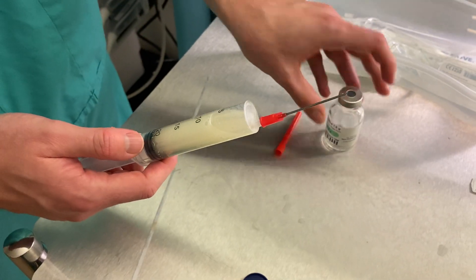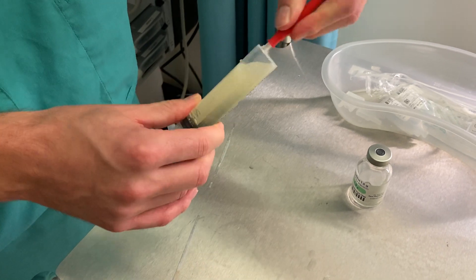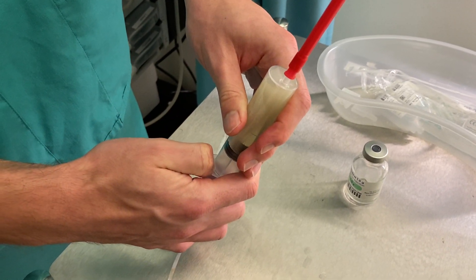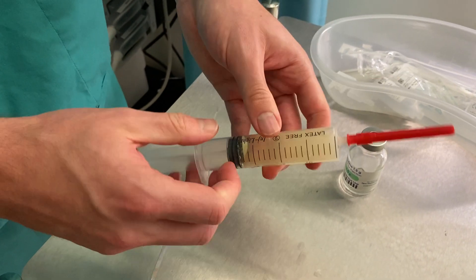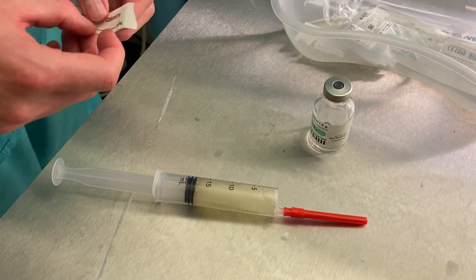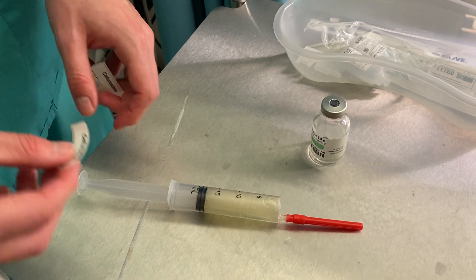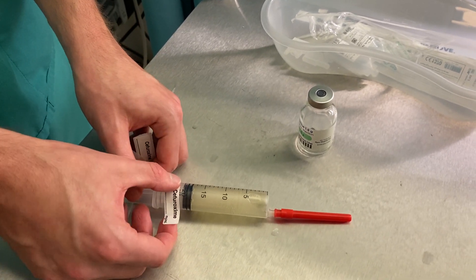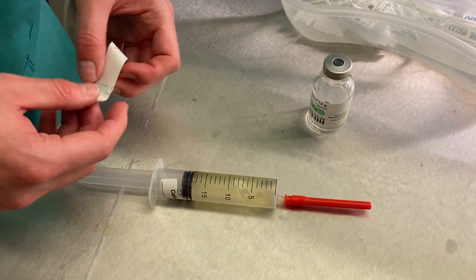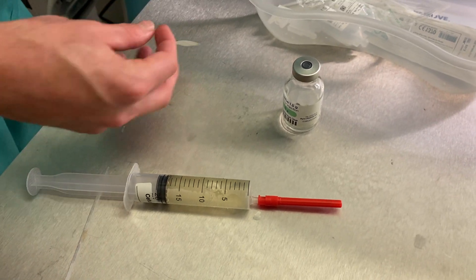If you need to make your antibiotic up to a specific volume you now can. Most of the time in theatre, once it's between 15 and 20ml or so, we're happy. It doesn't need to be a specific concentration for some antibiotics and we can give this as a slow push. Be careful of some antibiotics that need to be made up in larger volumes, such as vancomycin, and give them nice and slowly to avoid infusion effects like red man syndrome. But for simple penicillins and cephalosporins like this, that's how we draw them up and that's how you'll make up your drugs.